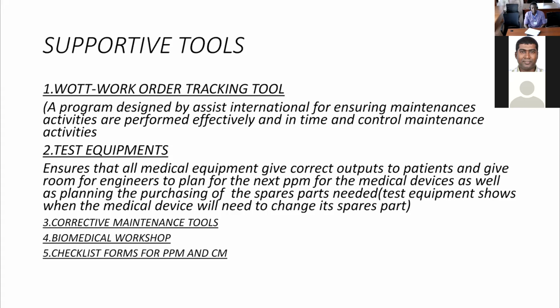And the third, we are having the corrective maintenance tools. They are very nice, very good, provided by Assist International, oscilloscopes and other devices, which we use to do corrective maintenance. They have highly contributed to achieving a lot of medical devices being active in Mara region. Then we are having a biomedical workshop.